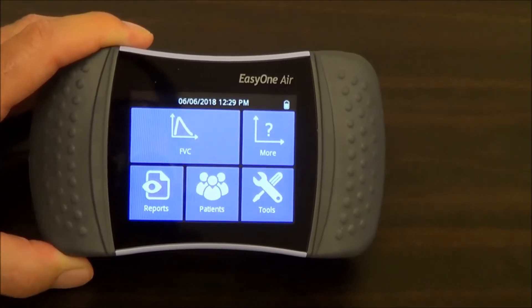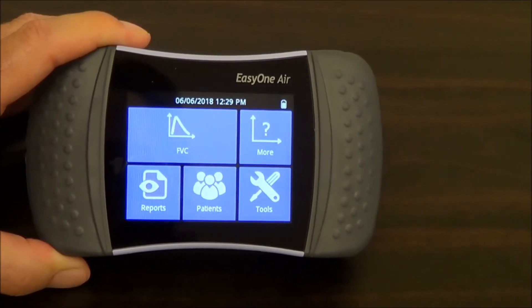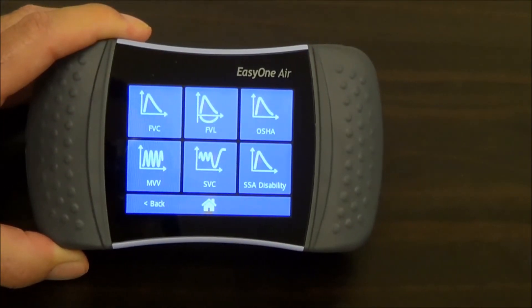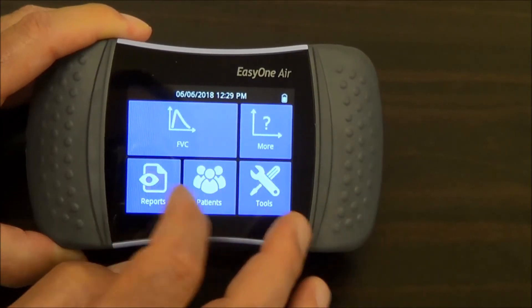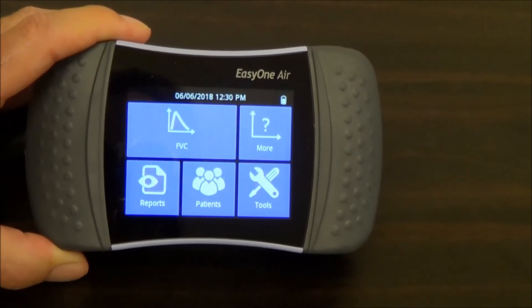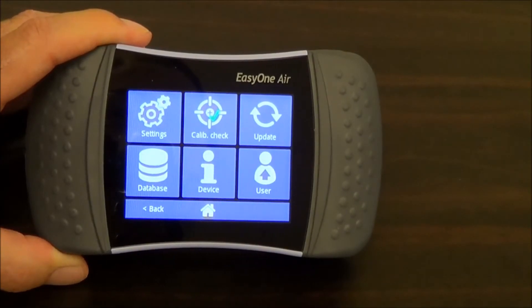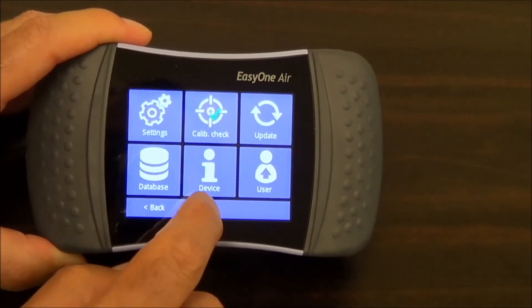This is the main menu that you see when you turn the device on normally. At the top you've got a test type — it's typically how you would start your test. There is a default setting for the FVC test. To get to more test types, hit the more button and you can see all the test types available within the device. Reports allows you to access tests that are already saved if you want to print or review them. Patients lets you see the patient list or review reports against a particular patient. Tools gets you to a deeper level of configuration menus to customize the device. And the home button is always there to get back to the main menu.